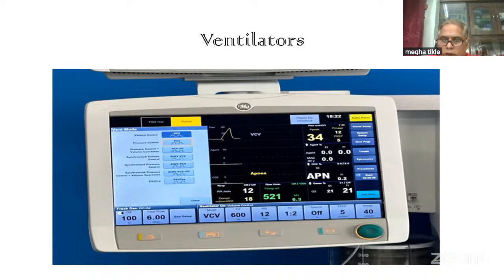Because during very low flow or metabolic flow anesthesia, there is uptake of oxygen. So you have to know what is the inspired oxygen concentration and the expired oxygen concentration. Because we usually do not completely denitrogenate the patient, there will be a discrepancy sometimes.